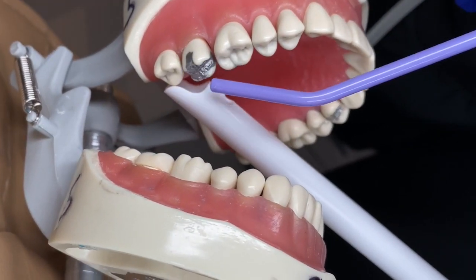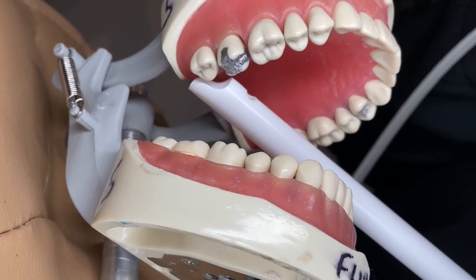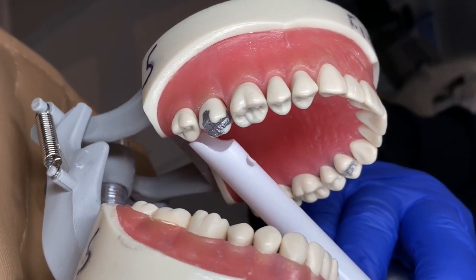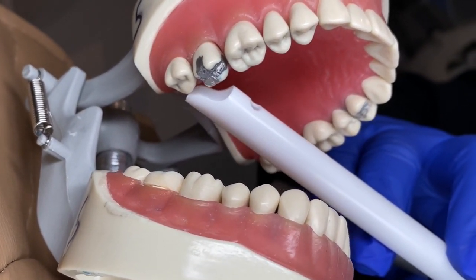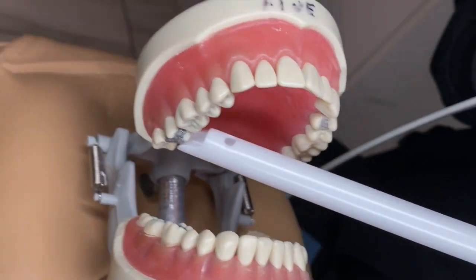If they're on the occlusal, buccal, or lingual of tooth two, you could also be in the same position. You're not going to rest your suction on the gums — you don't want to push on them. You just want to kind of hang around on the tooth, because if you push on the gums it's going to hurt the patient.